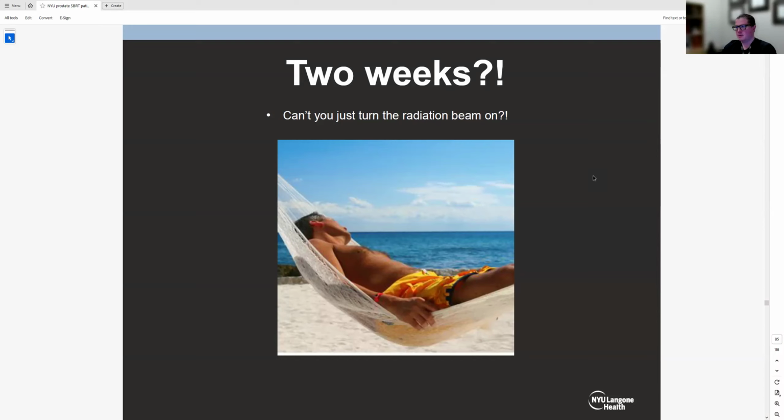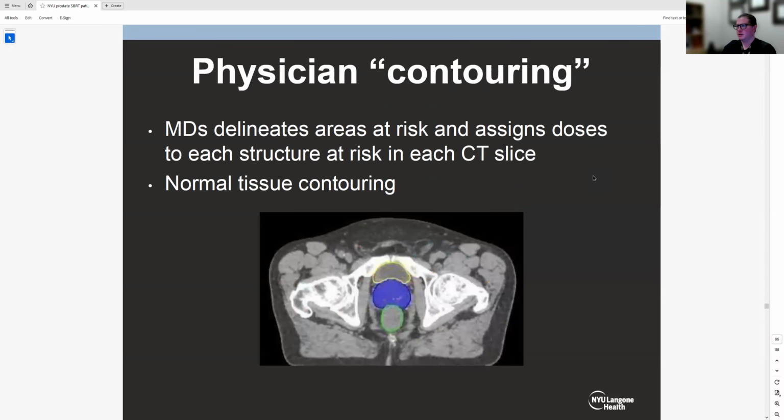And doing that involves a lot of people. The radiation oncologist will actually create the drawing using a CT, maybe an MRI, maybe a PET scan to really iron out where we want to treat. And then another couple of specialists get involved, usually a dosimetrist and a physicist, that help create a radiation plan using sophisticated computer algorithms that allow a particular beam arrangement and dose distribution such that all of the areas that I want to hit with the radiation are covered, and the areas I want to avoid are avoided. And so that does take some time, but it's all a personalized process. And once it's actually completed, that's when the patient will come in.